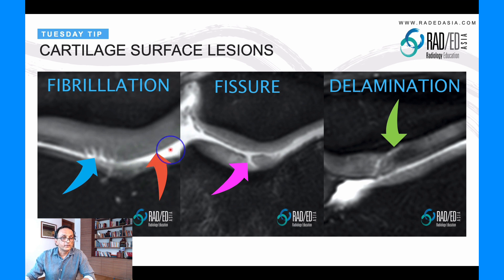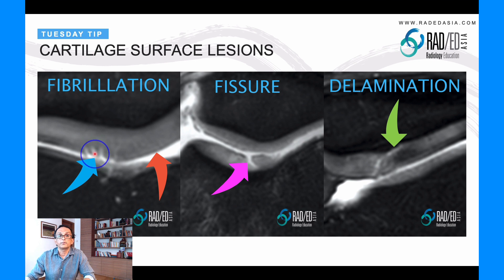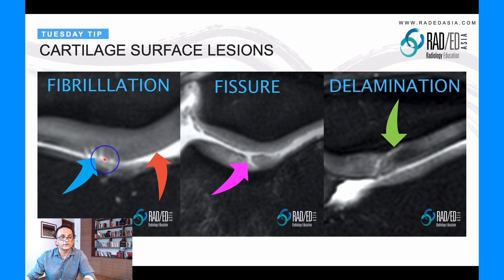This is fibrillation. Fibrillation is really this tooth-comb type appearance, where it's a jagged appearance that goes in and out, and you can see that the chondral loss is filled with joint fluid. The joint fluid is hyperintense on T2 or a PD fat sat, and that replaces the intermediate gray or dark signal of cartilage. So surface fibrillation is really just on the surface — you get this irregularity of the margin.